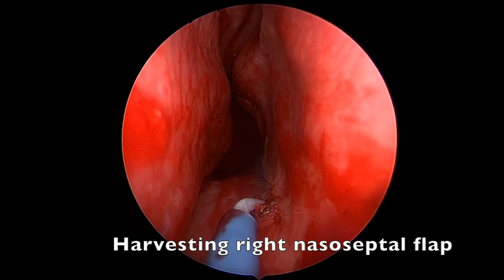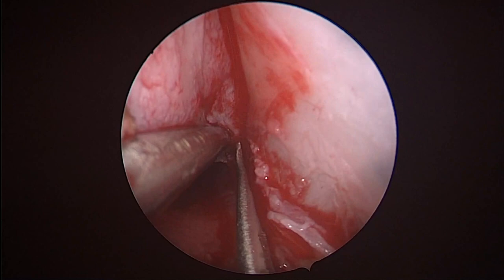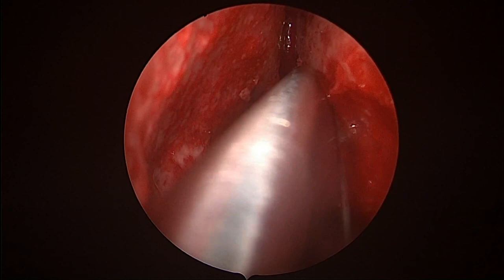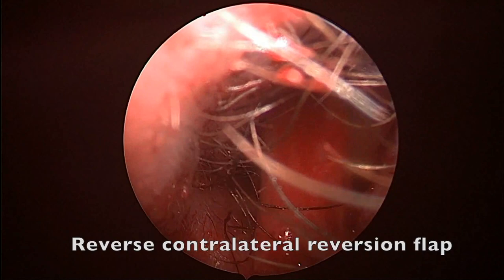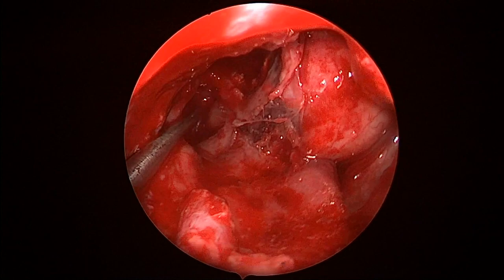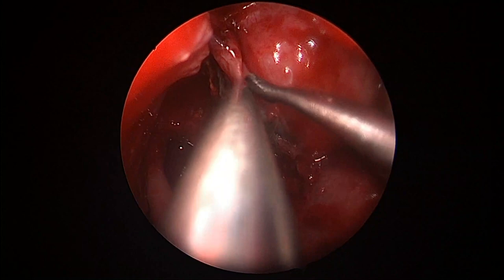We then moved our dissection to perform a nasal septal flap on the right side. The septum was exposed, the flap was reflected posteriorly, and we drilled the bone of the septum to expose the contralateral mucosa of the sinonasal cavity. A reverse flap was then created and the denuded portion of the septal flap anteriorly was accomplished. With a complete medial maxillectomy, we were able to expose the entire ventral aspect of the bulging tumor.